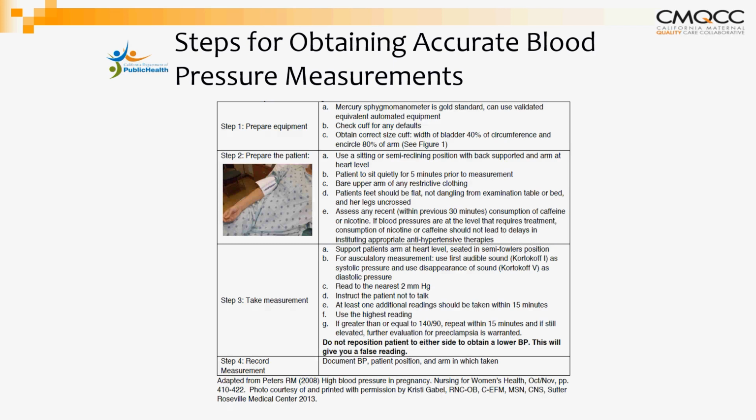We'd like to also include our medical staff as well, if they ever take blood pressure. So something like this slide that's posted may be a good thing to put out on the unit, or put for education for staff to look at, to ensure that they are making sure they take the blood pressure accurately.